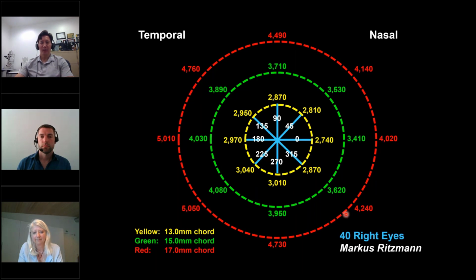The farther away we go away from the limbus, the more asymmetry we have around the clock. Generally, the inferior cornea had the greatest drop in elevation. So the inferior sclera. And that might suggest why our lenses tend to want to fall temporal inferior, because that's where the elevation of the eye is so low in this direction here.